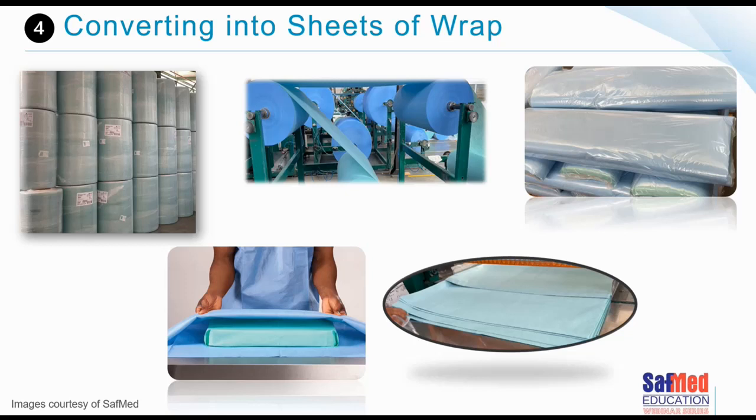The sheets are then placed into impervious plastic sleeves, and they're purposefully packed in 2 layers of plastic sleeves, so that when the materials arrive on site at your CSSD, you can remove that outer layering so that you don't carry any external contaminants into your CSSD, and that you then have a nice clean product to use. Of course, to wrap our sets for our patients.